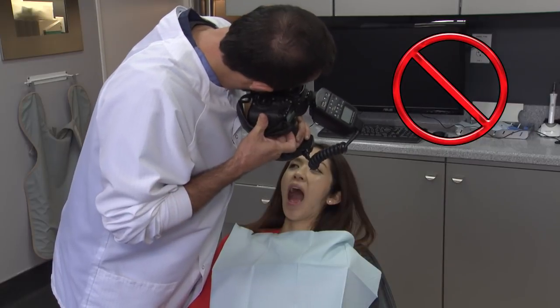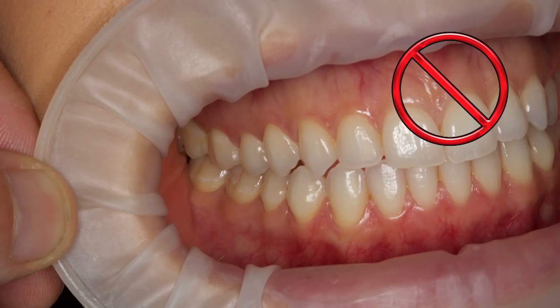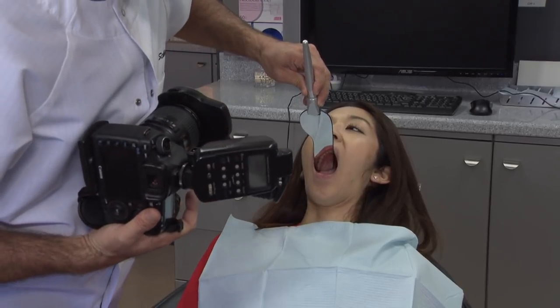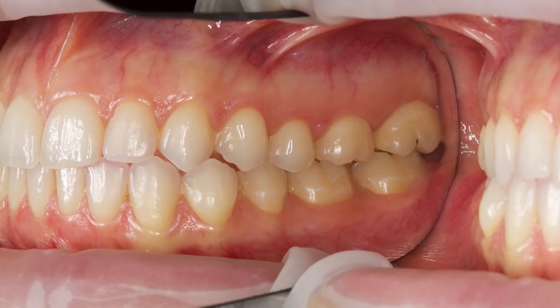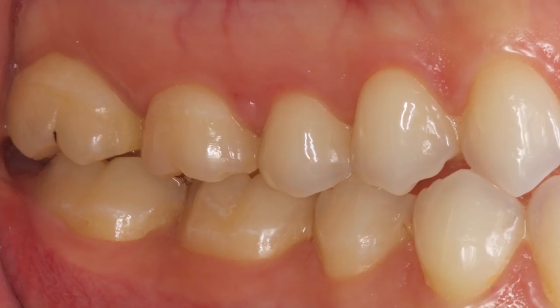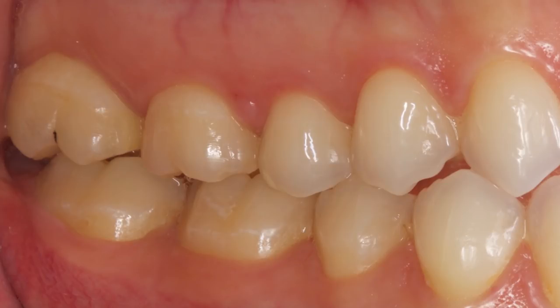Difficult to reach posterior intraoral shots can be aided with a clean intraoral mirror connected to a handle to retract the gingiva and reflect the subject area at a more direct angle, and then be flipped in post-production to give the illusion that the photo was taken without the distraction of the cheeks and lips.